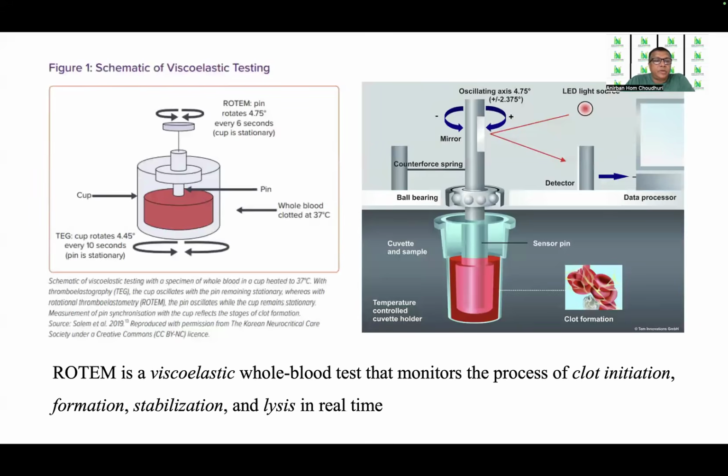Now, what is this ROTEM? ROTEM is a viscoelastic whole blood test that monitors the process of clot initiation, formation, stabilization, and lysis in real time. So we often talk about ROTEM and sometimes we use analogous interpretation about TEG, although both are the same, there are certain differences.